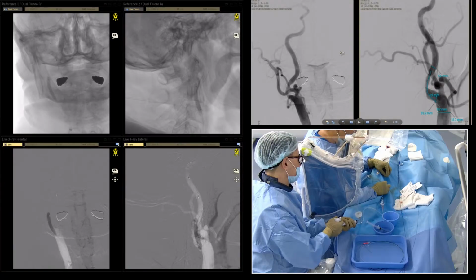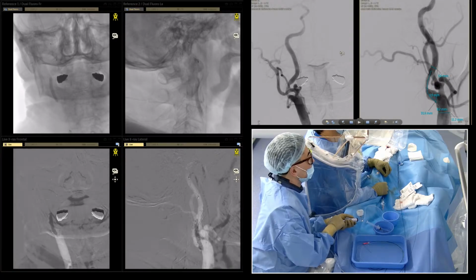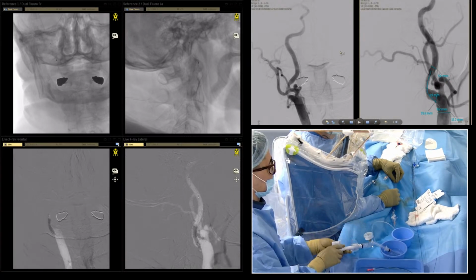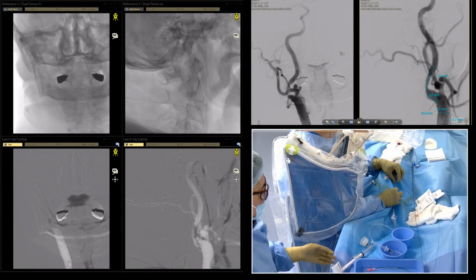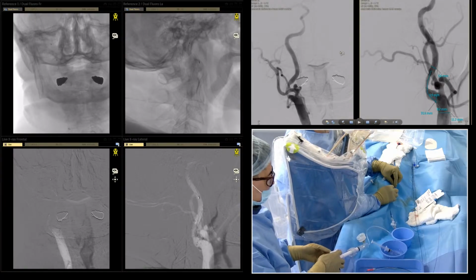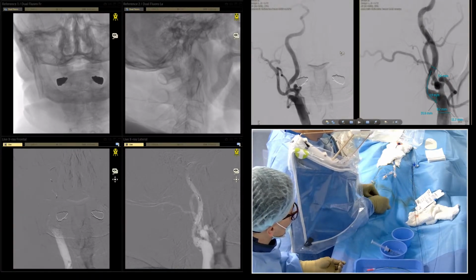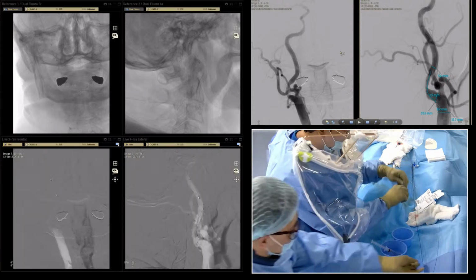Yes, now we'll give 20 atmospheres, which will be 4.8 millimeter. Everything back. Pressure, pulse. Yes, there is a slight bradycardia, which is 65. It's okay. We'll leave it. Maybe it will be needed for the post-dilatation.